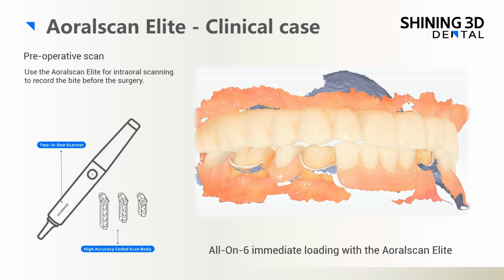Dr. Sun and his team proposed an implant prosthetic treatment in the mandible with an all-on-6 procedure involving immediate implantation and immediate loading. The patient had 3 remaining teeth in his mandible and uses a removable denture. 1 week ago, the patient underwent immediate loading in the maxilla with a 3D printed provisional.